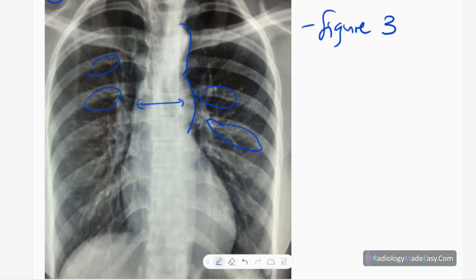So those are the two major abnormalities: figure-3 appearance and inferior rib notching. In this case, the diagnosis is coarctation of the aorta.